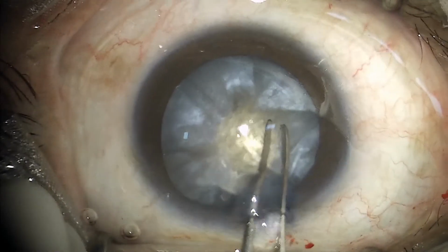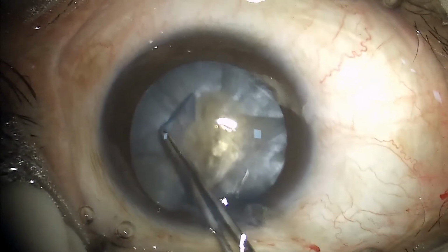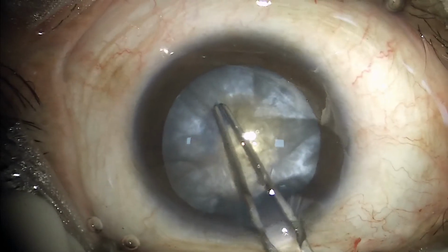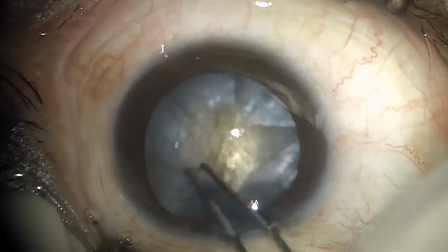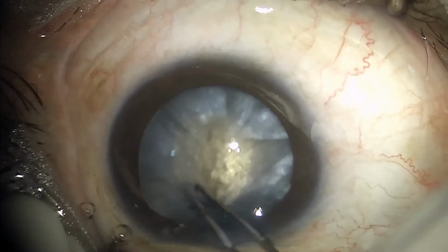Propagating the rhexis so that it is of adequate size now, and as you can see it is moving smoothly with no outward spiraling of the capsular tag. It's important to grasp and re-grasp as the rhexis progresses.